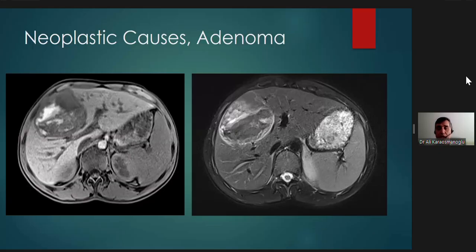So she saw a large mass in the liver. So adenoma was obviously considered, right, in a young woman with a history of contraceptive use. So an MRI was performed.